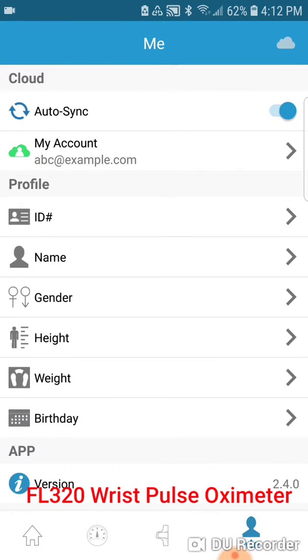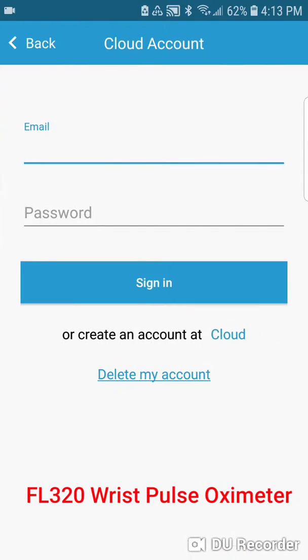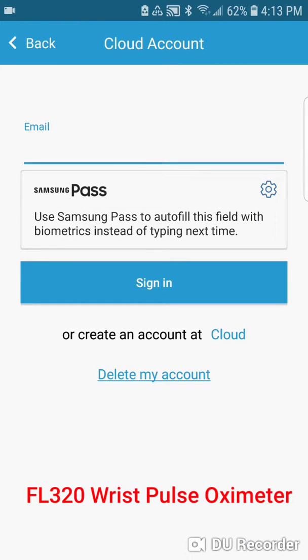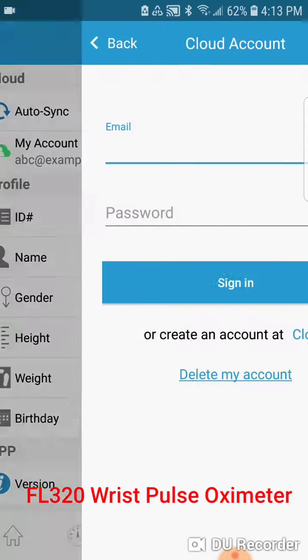There is also the me feature, which allows for the auto sync of data, as well as the my account option, which will allow you to create a cloud account for any transfer of data to said cloud account.